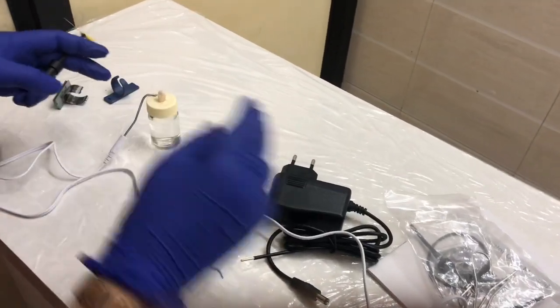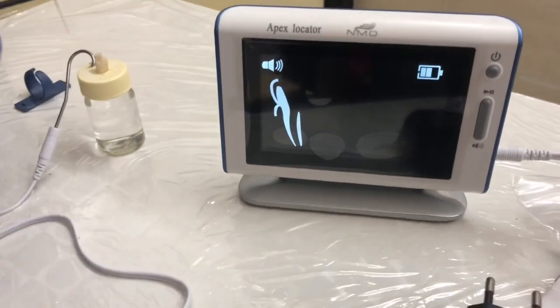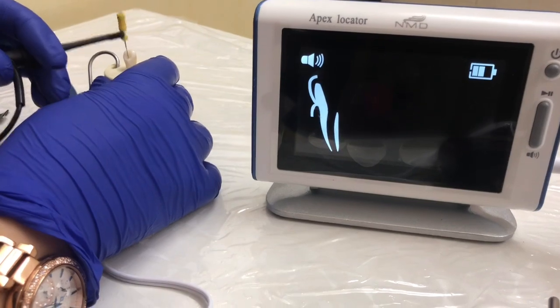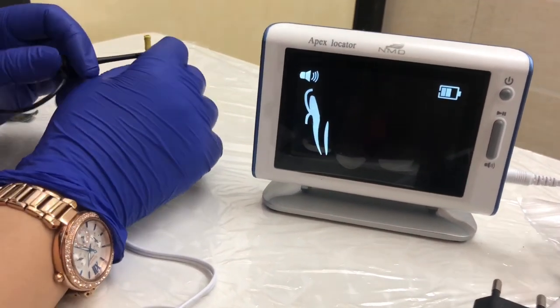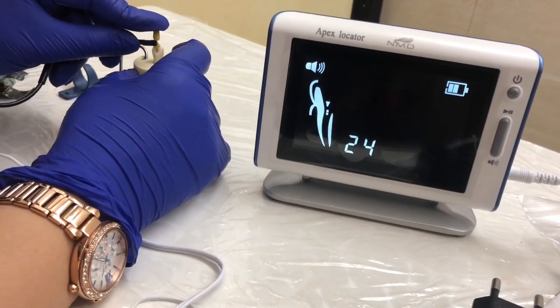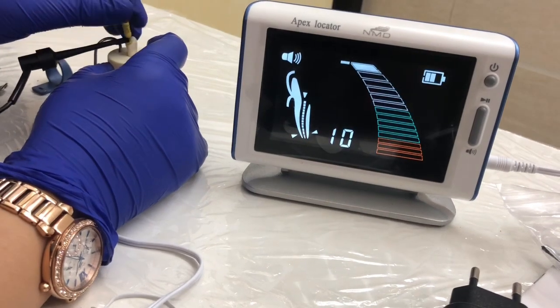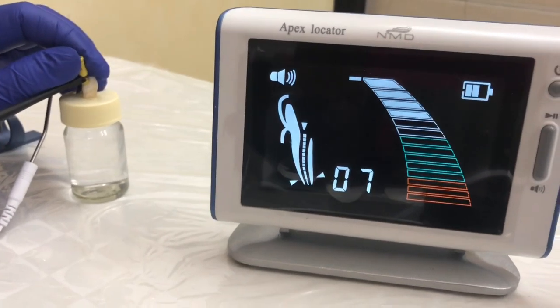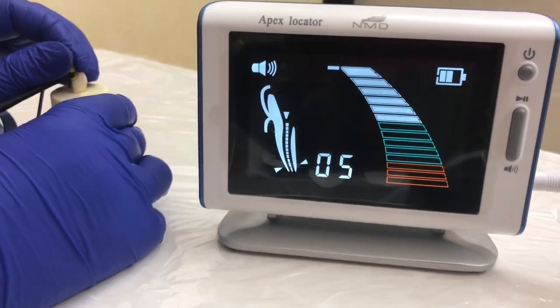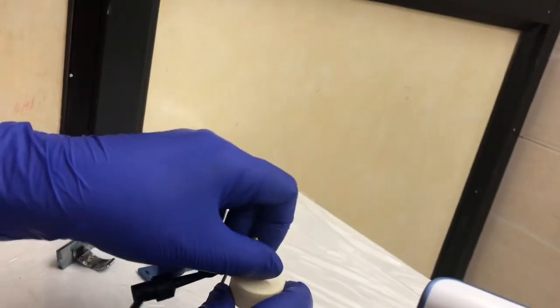You can see here — there is a continuous alarm basically when the distance is less than 2mm. This is the apex, and this is over the apex. I can show you on the route — now it's over the apex. You can see the file is going beyond the apex, so that's why it's indicating 'over'.